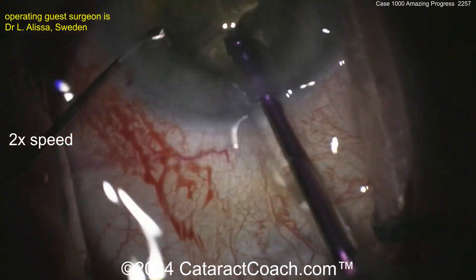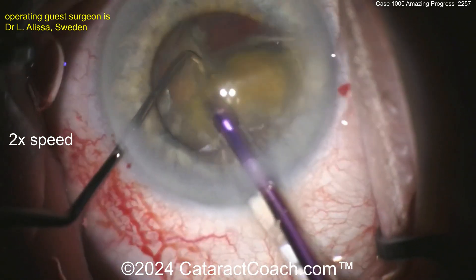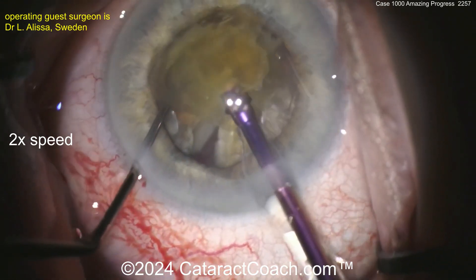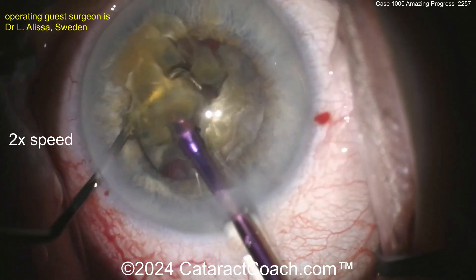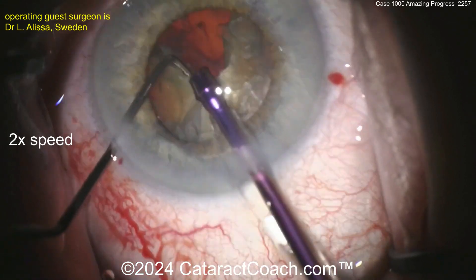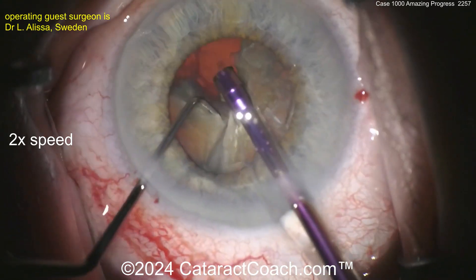First piece coming out of the bag already. Taking this piece down — the surgeon here has made a tremendous amount of progress. This is fantastic. For Case 1000, you're doing beautifully. Keep up the hard work. The surgeon was also very kind in saying that a lot of good pearls were learned from cataractcoach.com.